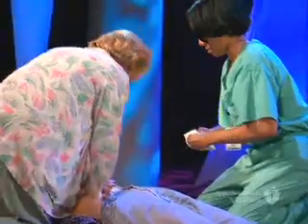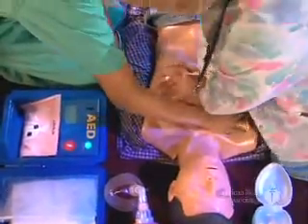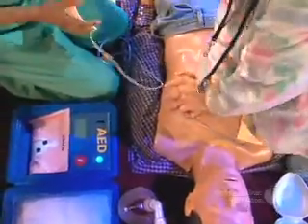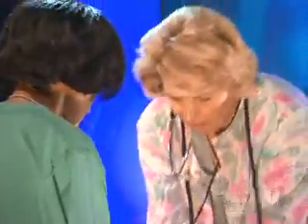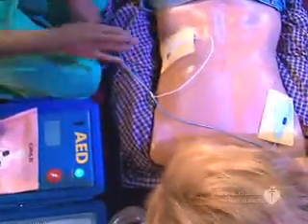Open the AED pad package and peel off the plastic backing. Press the sticky side on the victim's bare chest. Place one pad on the upper right side of the bare chest to the right of the breastbone. Put the other pad a few inches below the left armpit.